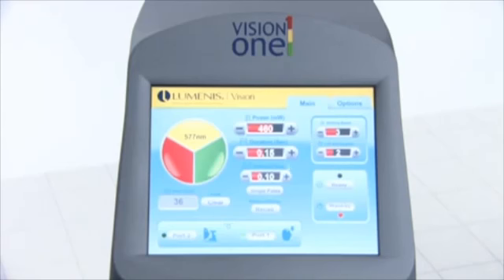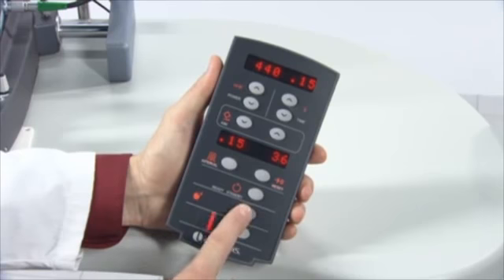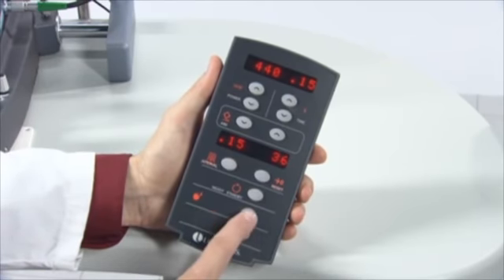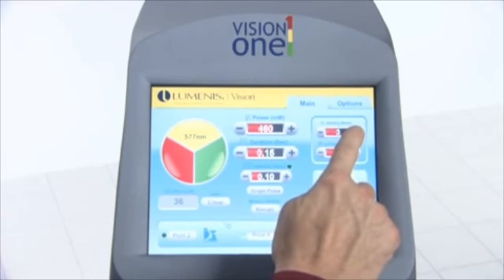To select the delivery device from the control screens, press the Port 1 or Port 2 selector next to the desired delivery device icon. A green light illuminates to indicate the selected delivery device. To select the delivery device from the remote control, press the delivery device selector until the icon for the desired delivery device illuminates.